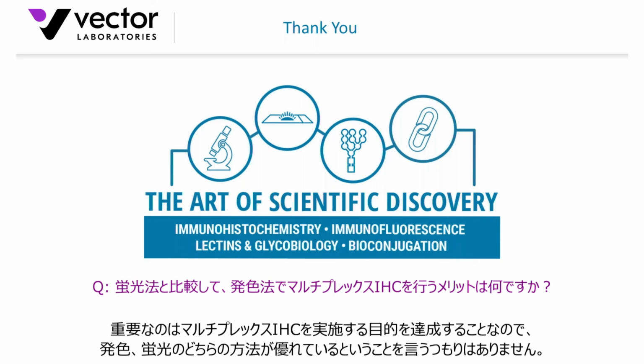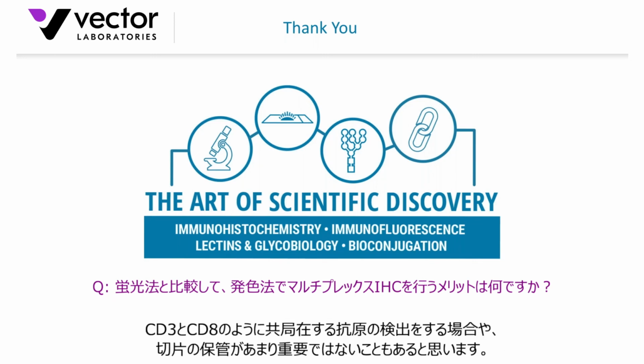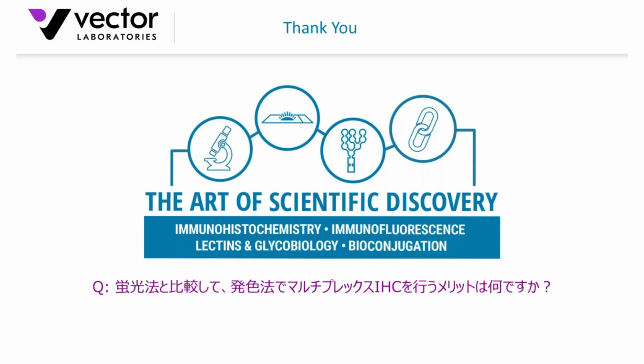So I think there are some significant advantages in using multiplex. I'm not going to say that one is better than the other. It depends on your application. As I indicated with the CD3 and the CD8, it depends on the application and the scope of the project. Archiving might not be important to you, but nonetheless, hopefully that gives you some insight into some of the advantages of using the chromogen-based systems.